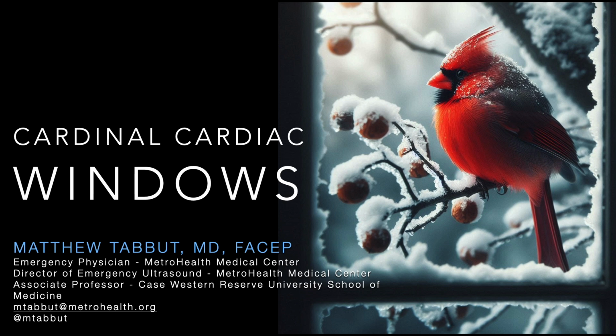Last week was an interpretive framework. Once you got the image, how do we think about it in terms of a clinical context, and how do we then use those findings on each image that we see and interpret that from a patient-oriented perspective? We didn't really think so much about what window we need to capture. We thought about, once we got our data, how do we look at that? What are the things that we want to see?